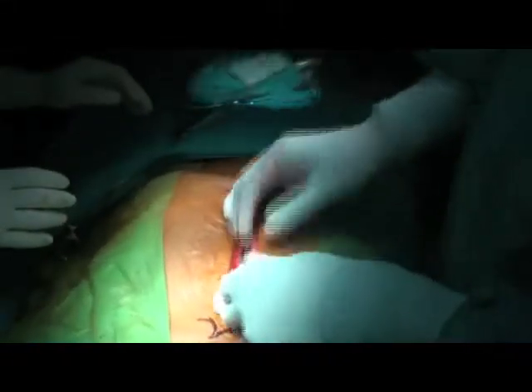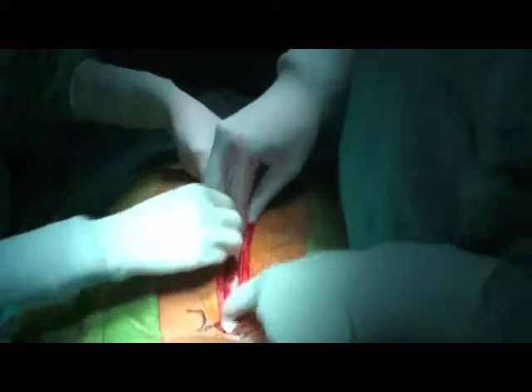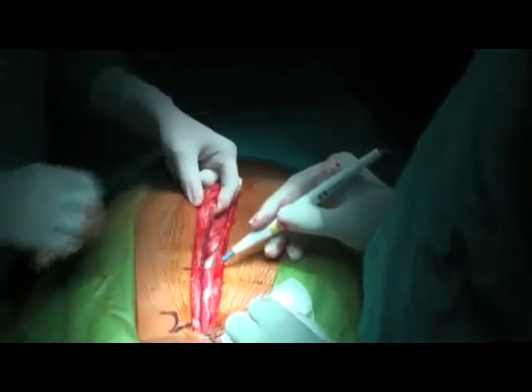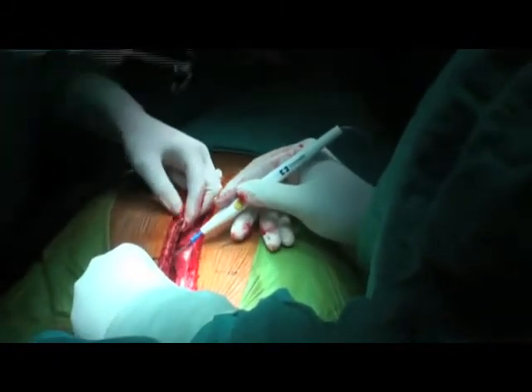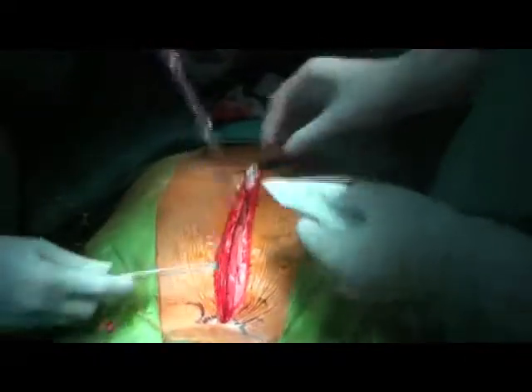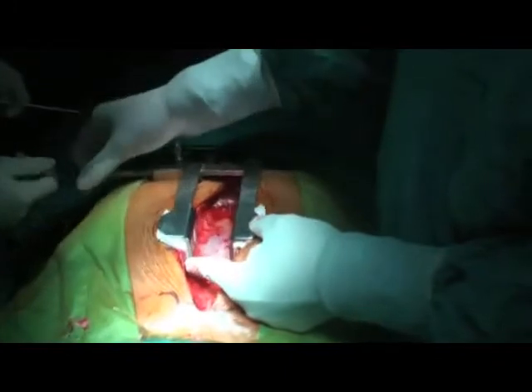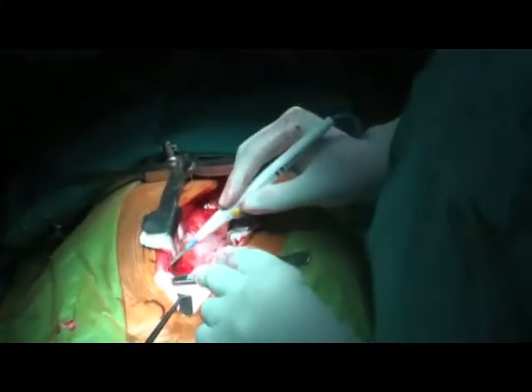Use a very minimal amount of bone wax to stop the bone marrow bleeding from the sternum, then coagulate the periosteal bleeders with the diathermy at coag 40. The assistant holds the sternum above and below so that you can see the entire sternal length. A small amount of blood will be absorbed by the sponge placed there. I use two swabs before placing the sternal retractor so that it does not fracture the sternum. This completes the sternotomy.